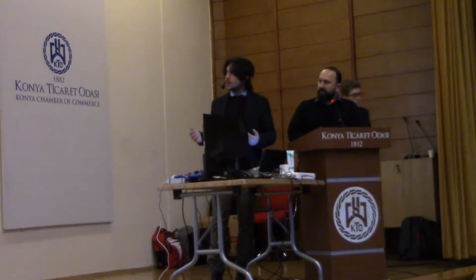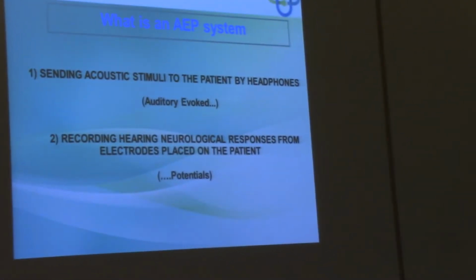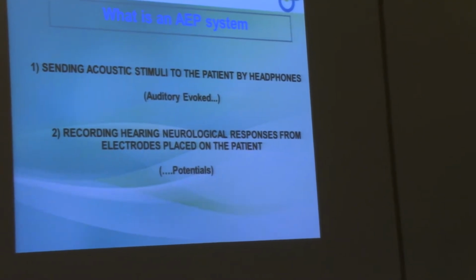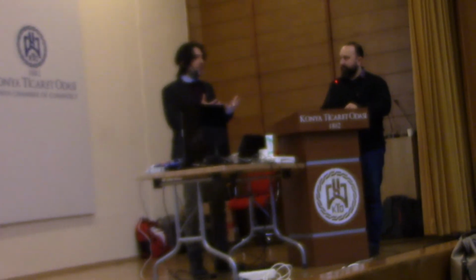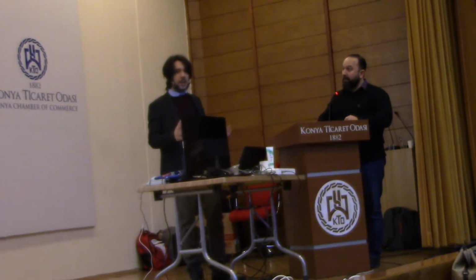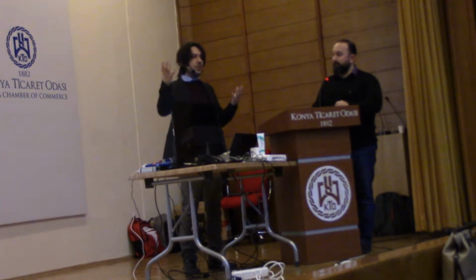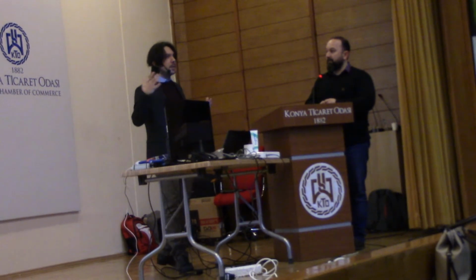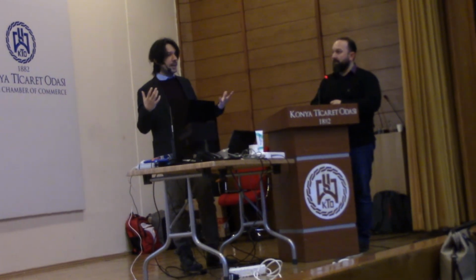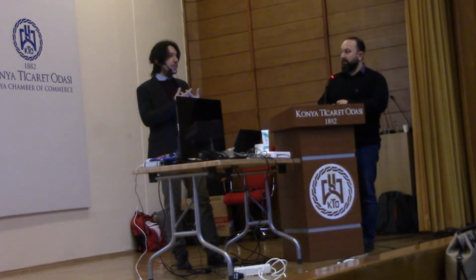From a technical point of view, as you all know, we are sending an acoustic stimulus, and we have a device that synchronizes the acoustic stimulus with the acquisition, with the response that is taken from electrodes. So these two things should be considered in your mind: the stimulus and the acquisition from electrodes. Stimulus from transducers, headphones. And the acquisition from the electrodes. They are synchronized because they should be correlated, otherwise it's not a response.